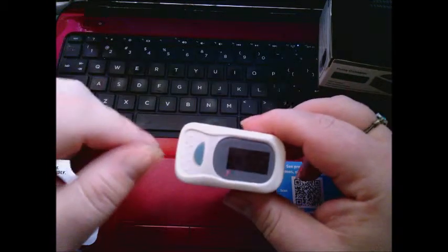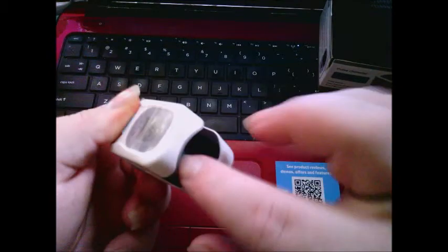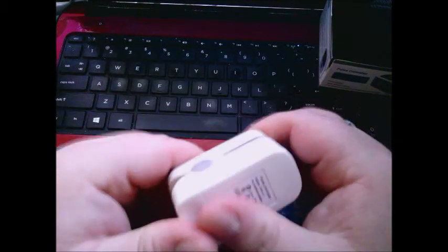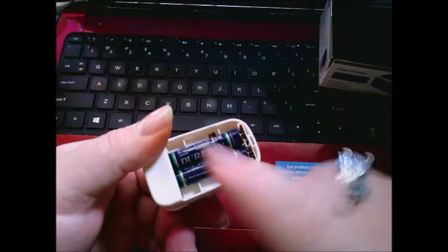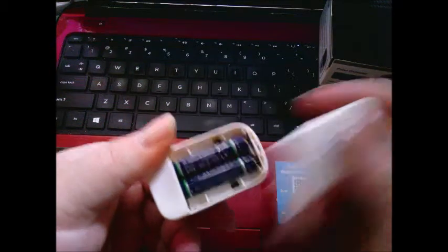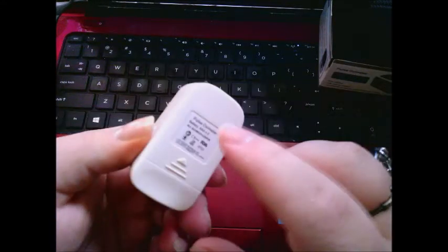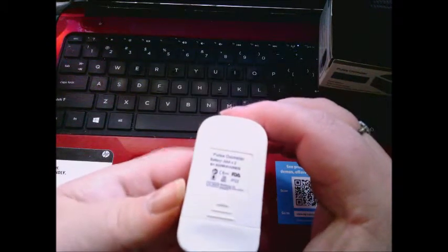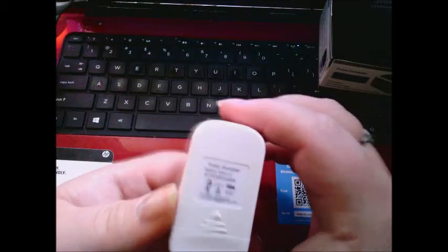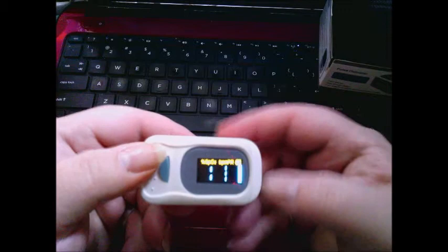It has a little plastic protector sheath on it. Here's the basic layout — you stick your finger in here and it reads out up here. It takes two triple-A batteries, which is really nice. I've seen some of these where you have to put those big button watch batteries inside, but this one just takes two triple-A's.